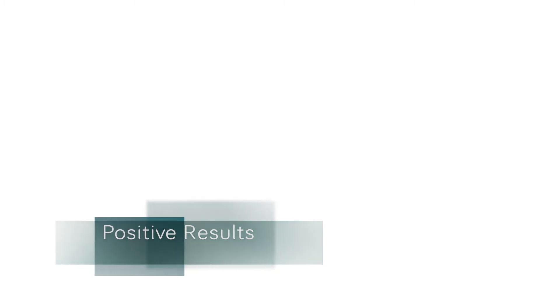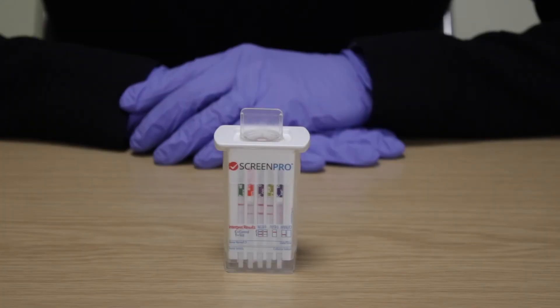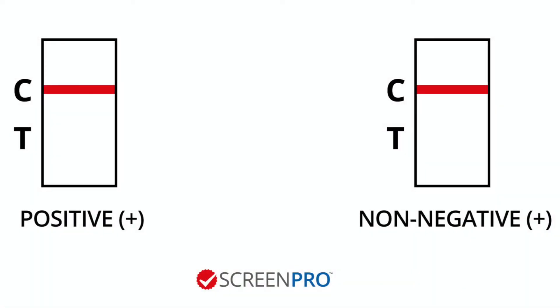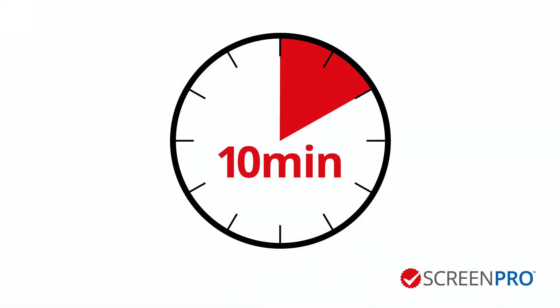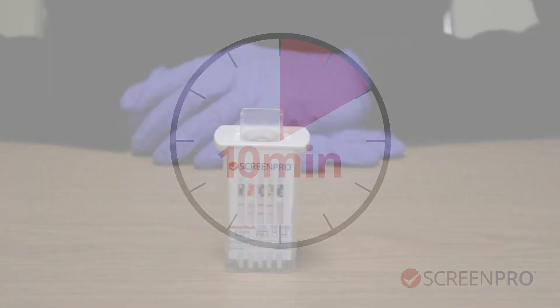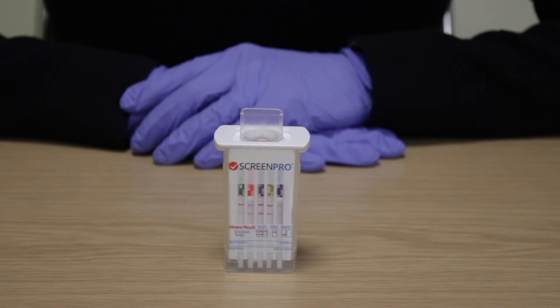Positive, also known as non-negative results. The presence of a reddish purple line at the top C position and no line at the bottom T position on any of the test strips indicates a non-negative result for that drug. Non-negative results should be read at 10 minutes. All non-negative results should be sent to a suitably accredited laboratory for confirmation analysis where required.